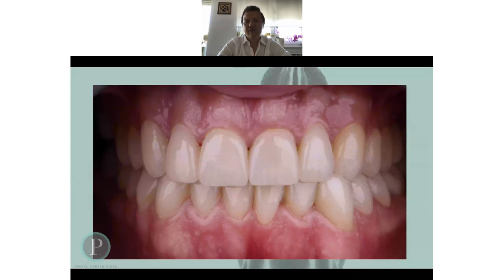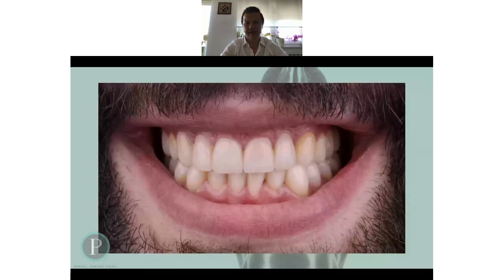When we speak about this product, what I like is, when I recommend it to the patient, that they don't lose the character of the tooth which they had. It's easiest to achieve white, to have a bleach, or to have the teeth in one line. This is the easiest for every technician, and of course the easiest for us when we do preparation. As you saw, this lower left canine, number 33, was very out of the line, and when I did the plan and had the discussion with the patient, I said, don't lose your character.